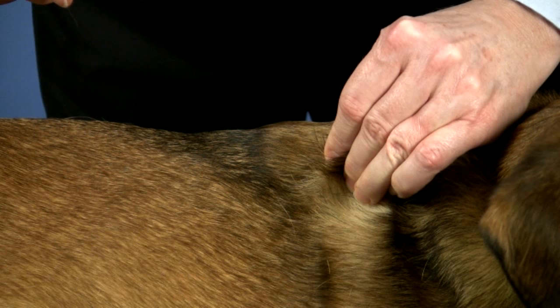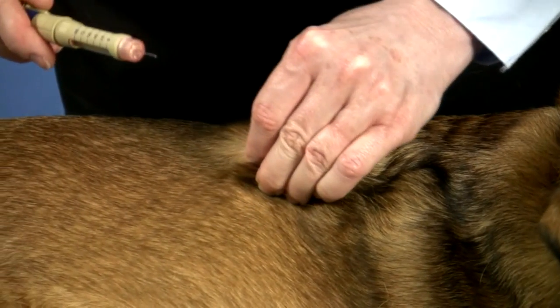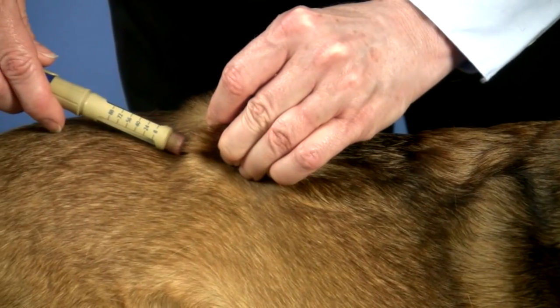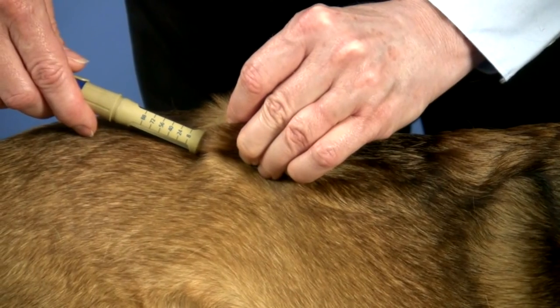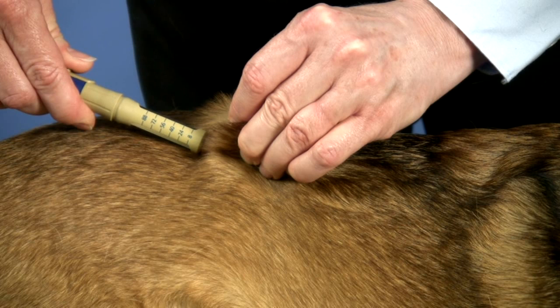Make sure to rotate the injection site as advised by your veterinary professional. As shown here, you can inject your pet between the area behind the shoulder blade to the middle of the lower back. Insert the needle through the skin using the injection technique recommended by your veterinary professional.